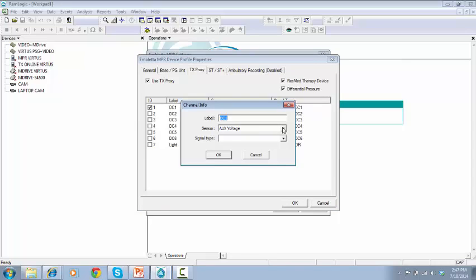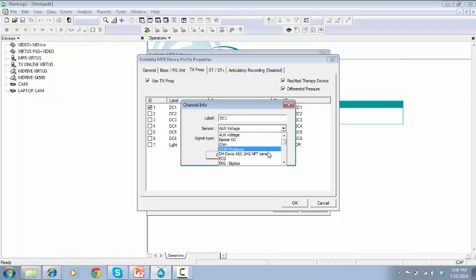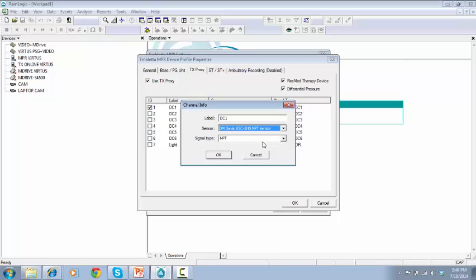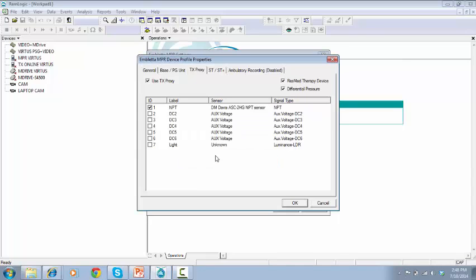Select your preferred sensor. Choose the proper signal type and type the label for that sensor. Click OK.